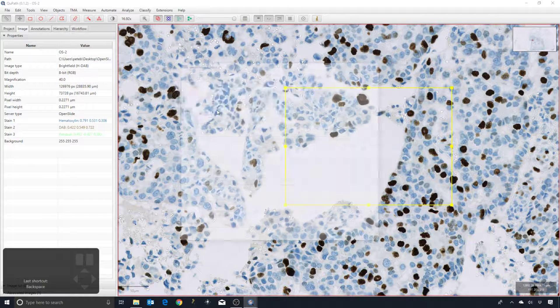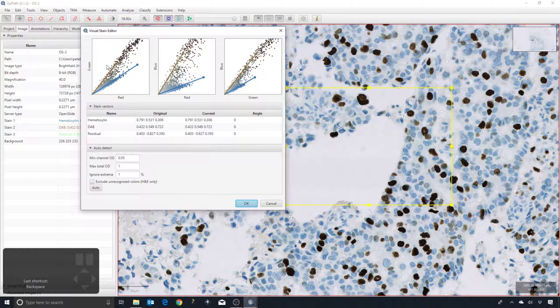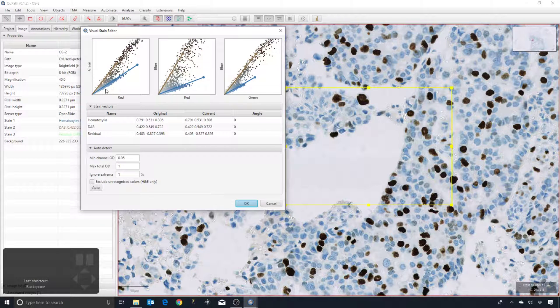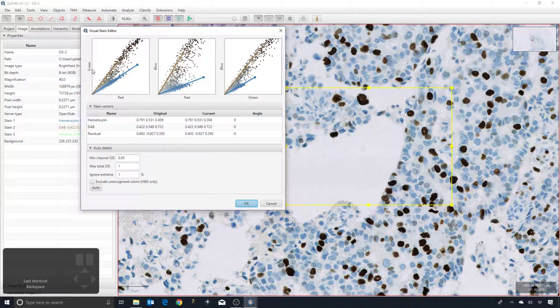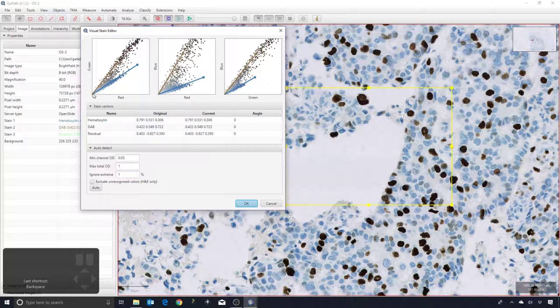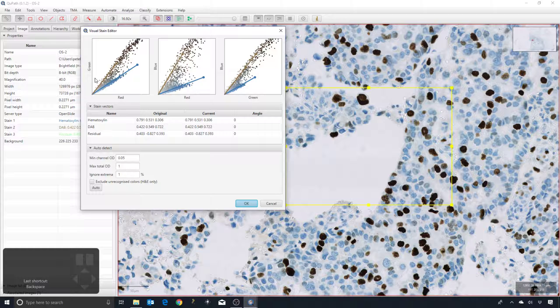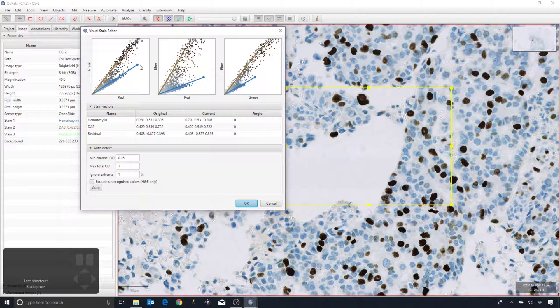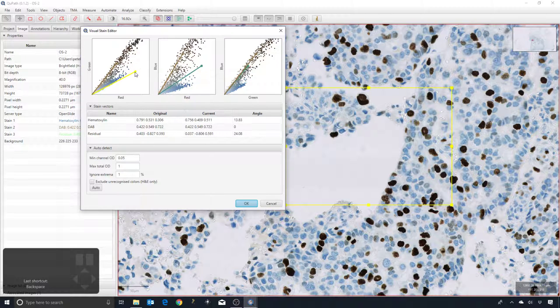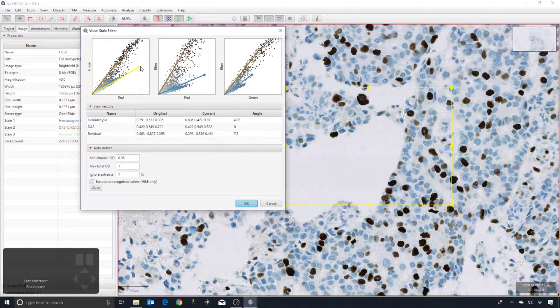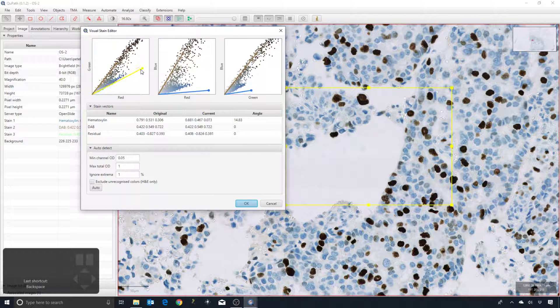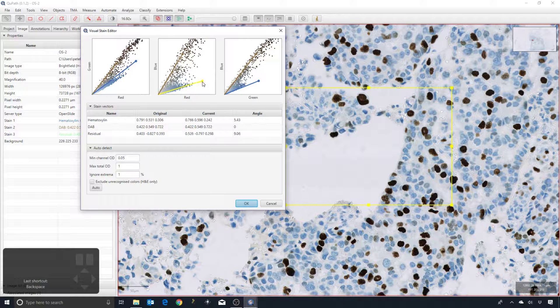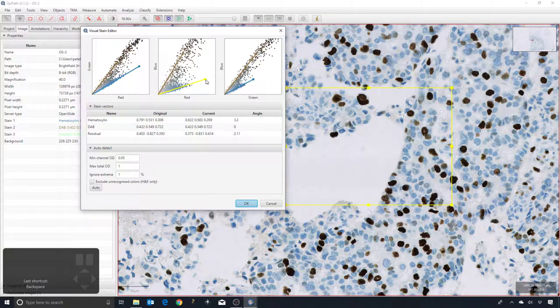The next thing that comes up is these scatter plots. For each pixel then from this region that QuPath has extracted, it shows me the plot of the red value versus the green, the red versus the blue, and the green versus the blue. You can see that they fall in this kind of triangular cone-like shape. These lines are the stain vectors that we set before, and we would want these lines to really go along the outside of this kind of cone. We can actually click on the end and we can try and adjust them until they do that. It's a little bit hard to control whenever you're trying to modify a line in 3D from these 2D scatter plots, but it at least is possible.